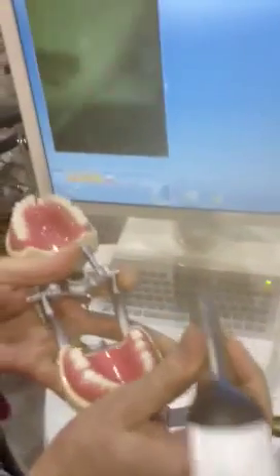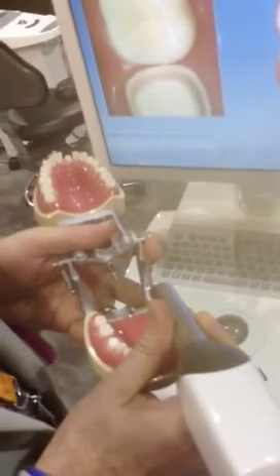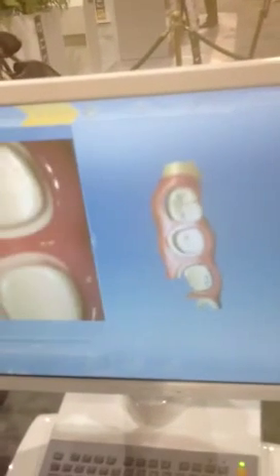Let me turn the camera on and you can gather in close here. If you can use an intraoral camera, you can color stream as well. You place the camera and it starts taking the information. You'll see the white highlight, which is the aperture of the camera. You roll the camera as you go, getting all the information from the buccal, lingual, and occlusal. And in just a few seconds, you scan the full quadrant.